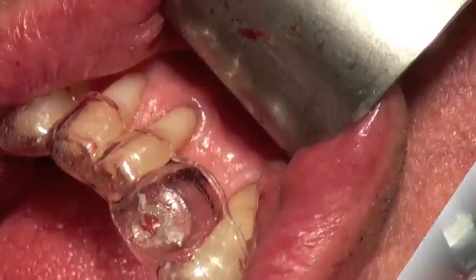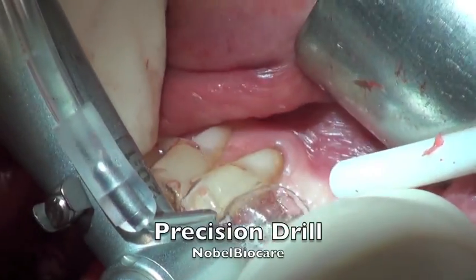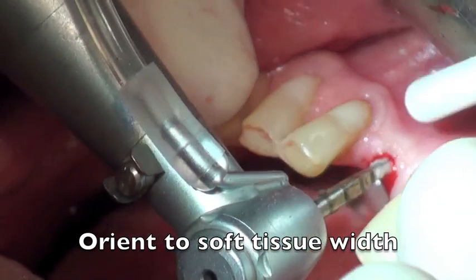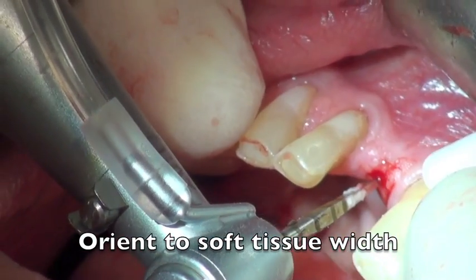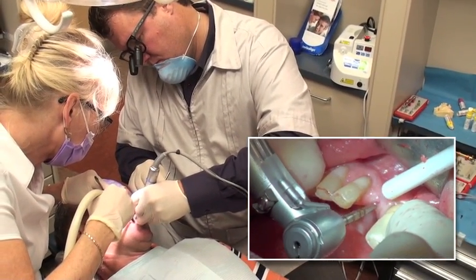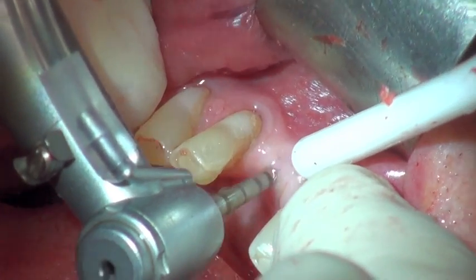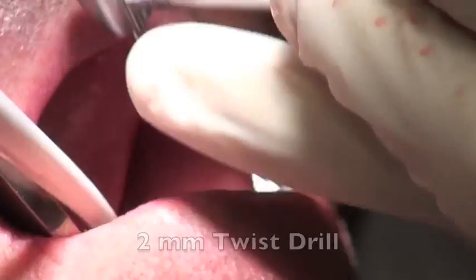The next step is to place the surgical guide, which allows us to provide the angulation. Using the cone beam technology to visualize how the bone is, we use a precision drill to come in contact with the ridge. It allows us to feel the ridge and feel exactly what we're seeing on the cone beam scanner, pinpointing exactly where we want to access the ridge and making the drilling process much easier.